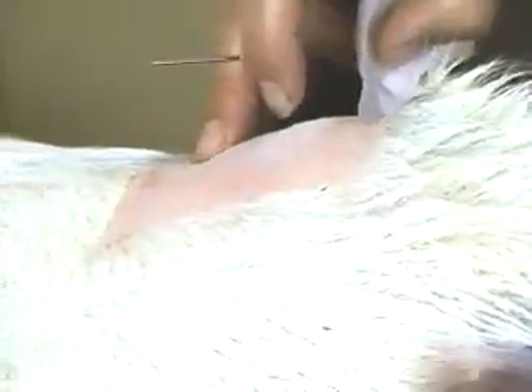The first joint where you can see some movement will be the sacro-coccygeal junction, and you can feel it as a little depression — maybe an area that feels like it compresses on your finger as you elevate the tail. That's the best site.